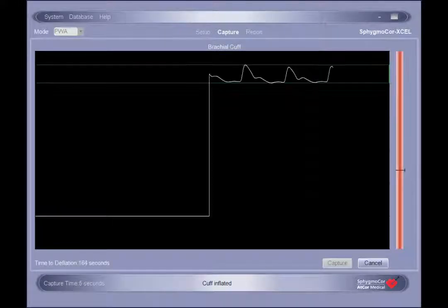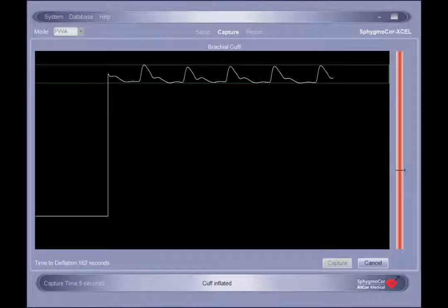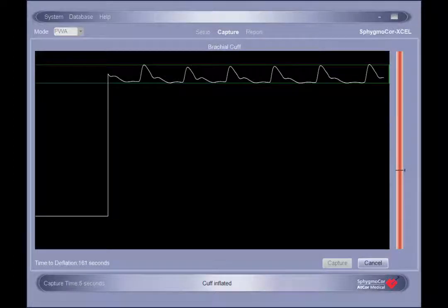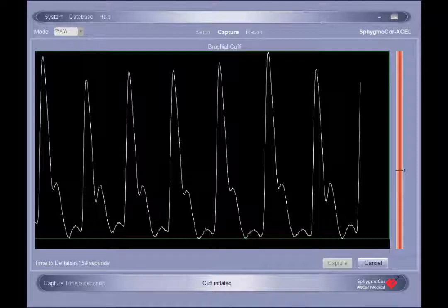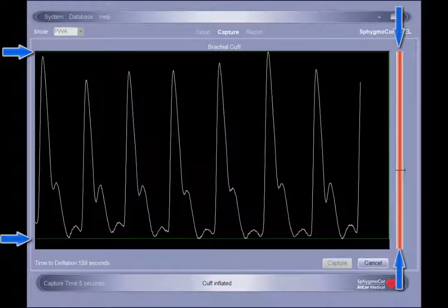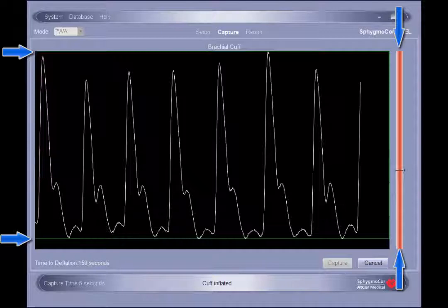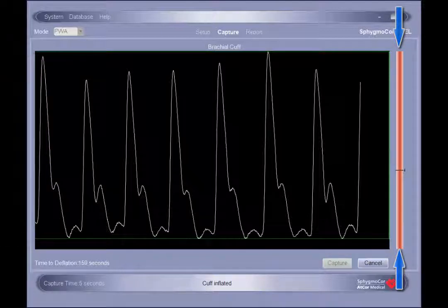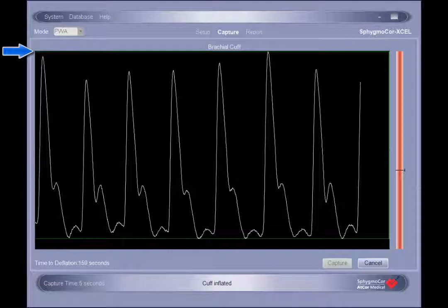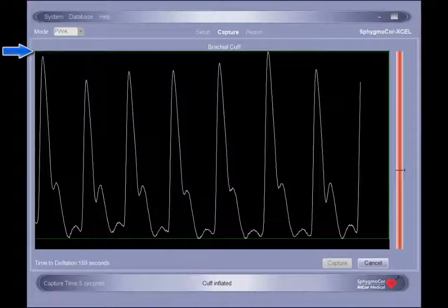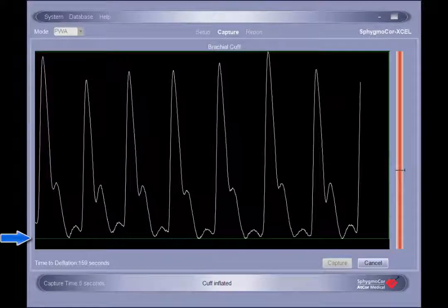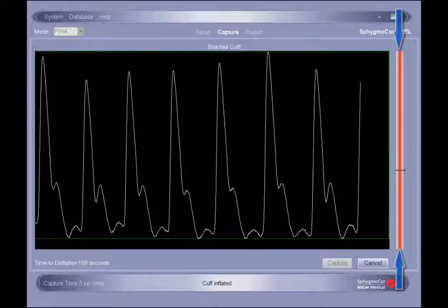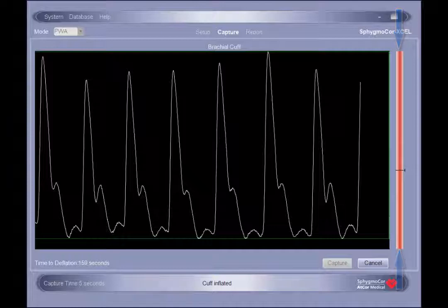During waveform acquisition, the guidance bars evaluate the signal to provide information about the consistency and amplitude of the waveforms. The horizontal bar at the top of the tracing evaluates the consistency of the waveform peaks, the horizontal bar at the bottom of the tracing evaluates the consistency of the baseline, and the vertical column to the right of the capture screen is an indication of the signal amplitude or strength.